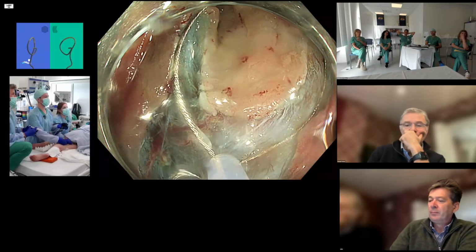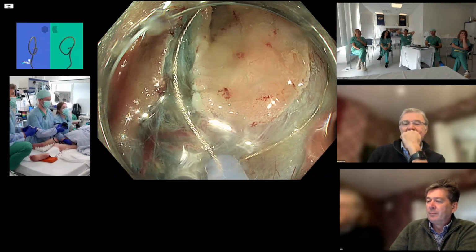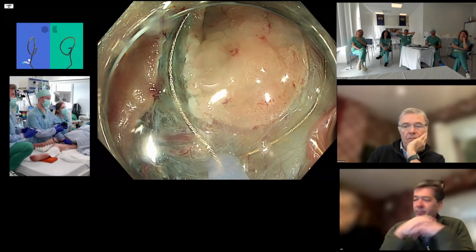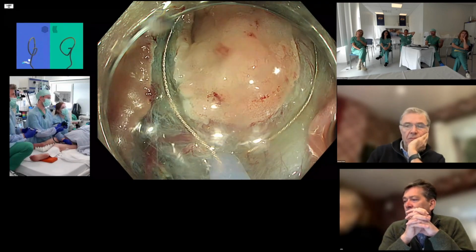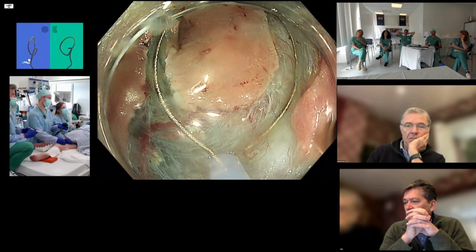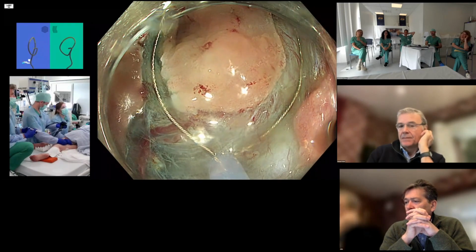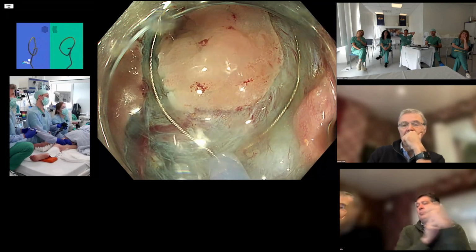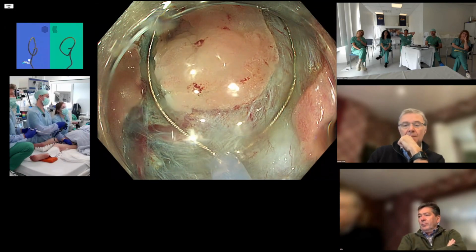No, don't take the snare in. You're in a great position. You just have to control it more. And the control comes from suction. The control comes from maybe even underwater. You could think about underwater for this. That's not a bad idea, I think. You need to control the snare better. And Xander, this is a great one for you. And it's great television, because if you can do it, everyone's going to cheer at the end, right?